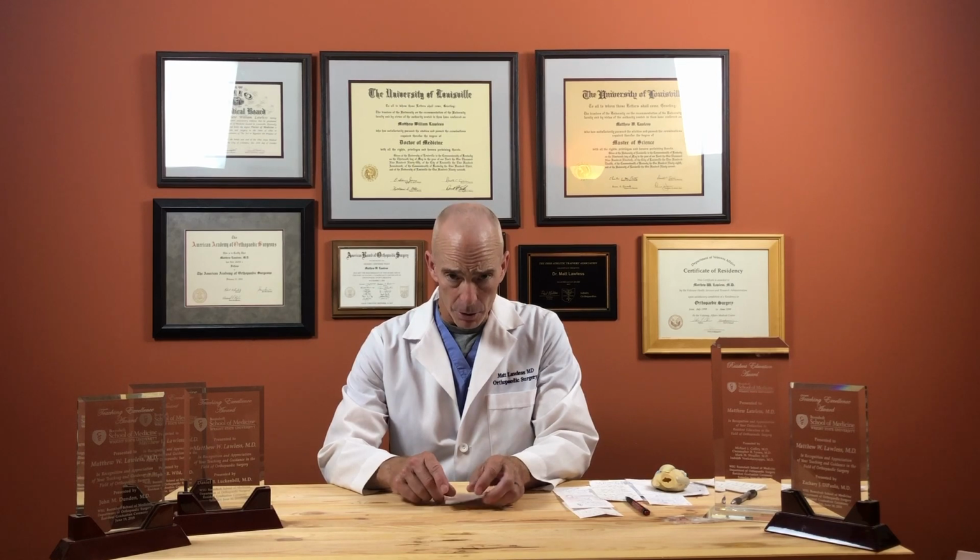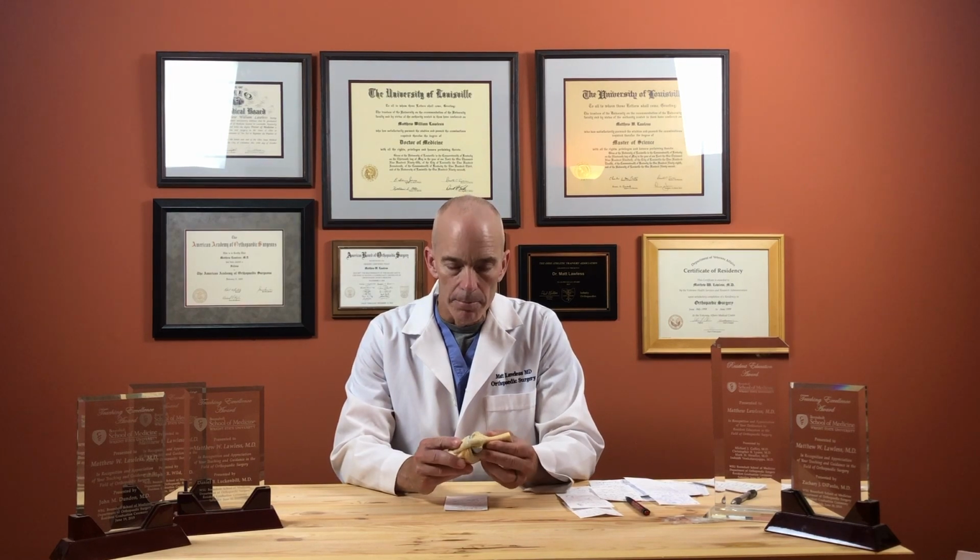Today I'd like to talk about robotic-assisted total knee arthroplasty. Total knee arthroplasty is a surgery done for people with arthritis. What a total knee does is essentially resurface your knee. When the cartilage is gone on the ends of your knee, you get bone-on-bone arthritis. That hurts, and so we do what's called a knee replacement.